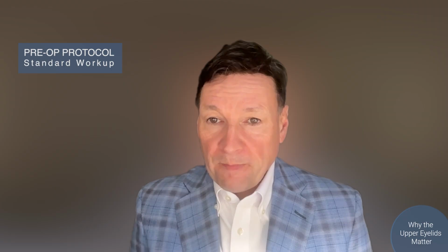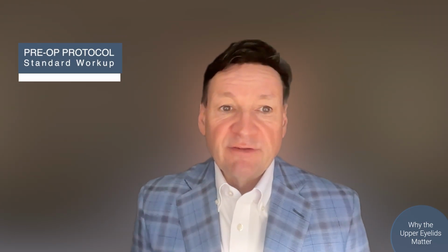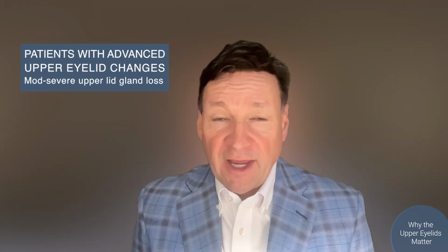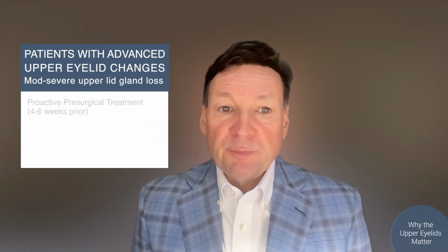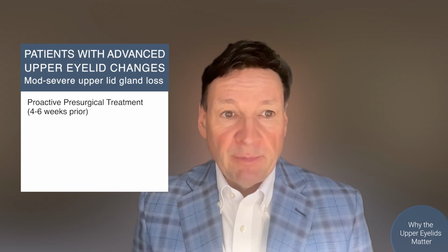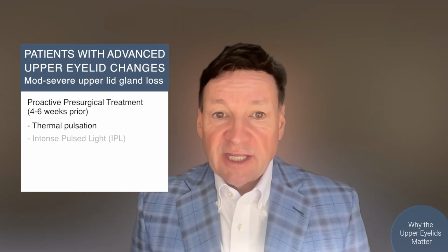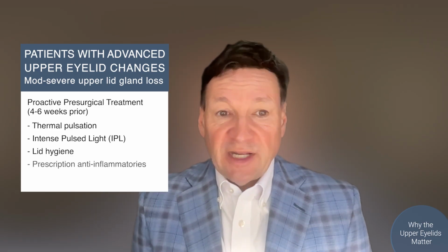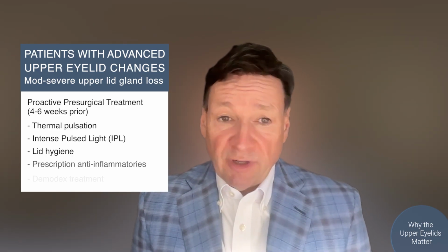Based on these findings, I have modified my preoperative protocol. Every cataract patient candidate now receives upper and lower eyelid meibography, alongside topography and macular imaging. Patients with more advanced upper lid changes, those with moderate to severe gland loss, are flagged as high risk. For those patients, I initiate proactive treatment 4 to 6 weeks before surgery. That might include thermal pulsation, intense pulsed light treatments, dedicated lid hygiene, and where appropriate, prescription anti-inflammatory therapy or Demodex blepharitis treatments.